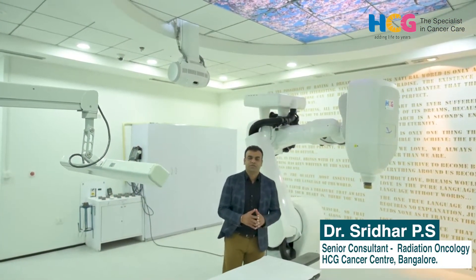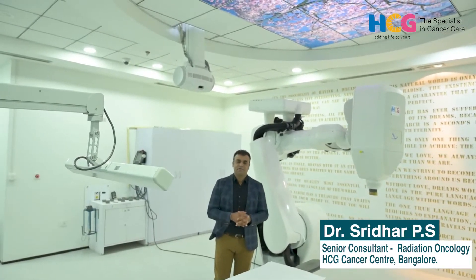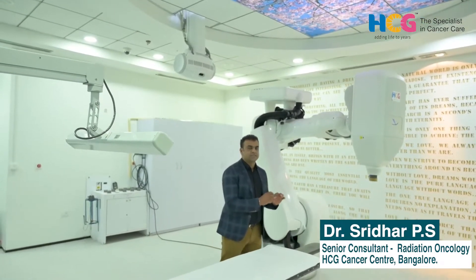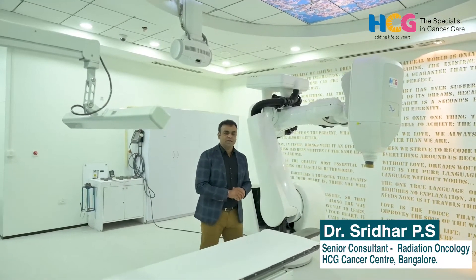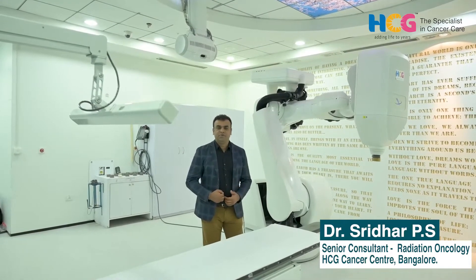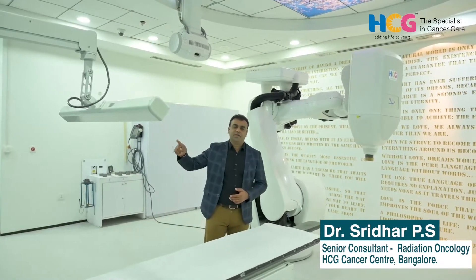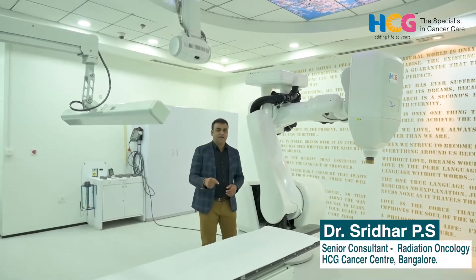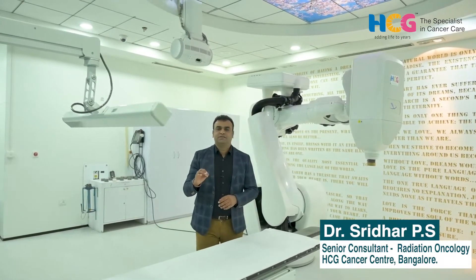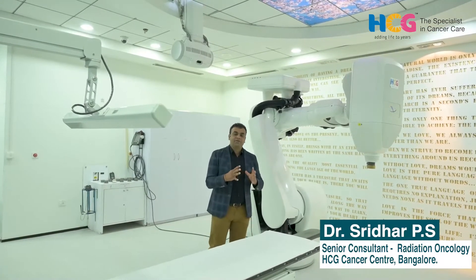The CyberKnife tracking system includes different methods: skull-based tracking, spine tracking, and for soft tissue we place gold seeds for soft tissue tumor tracking. For tumors that move with respiration — especially lung, liver, and pancreas — we use respiratory tracking, continuously tracking the respiration pattern and synchronizing with fiducial tracking to treat the patient very accurately.